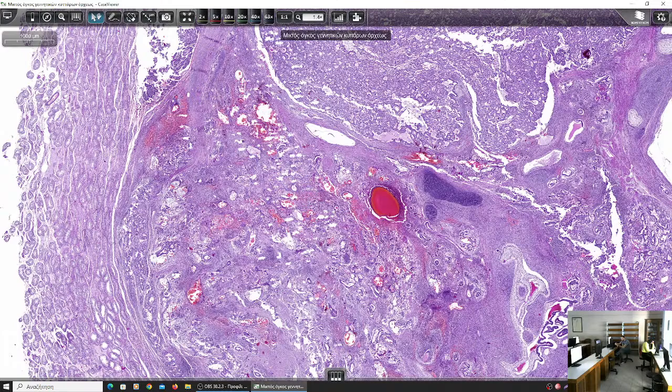Yes, when we have such single cells, we do not diagnose choriocarcinoma because this is another tumor. In order to diagnose a choriocarcinoma, the rule is to find both syncytiotrophoblastic and cytotrophoblastic cells in a biphasic pattern resembling the villi of the placenta.